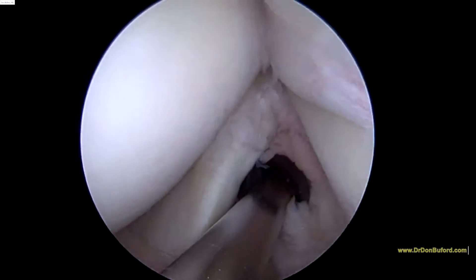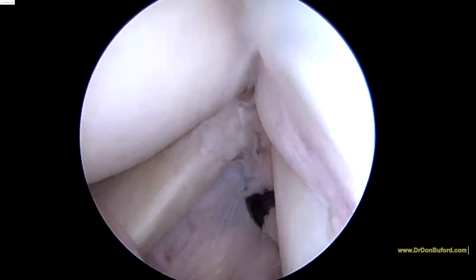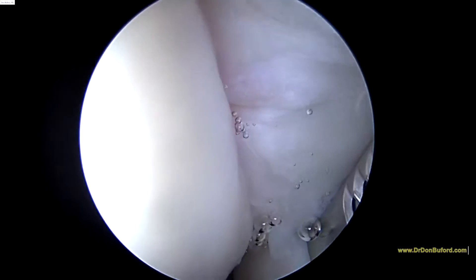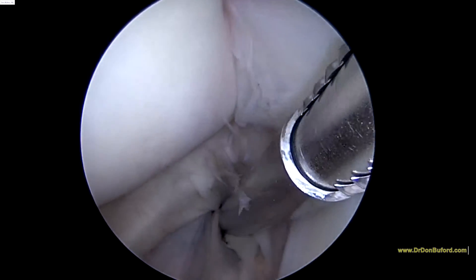We're going to come back up and look at the rotator cuff. I think we may have good news for you, at least on this side of the tendon. Things actually look pretty good. That really doesn't look like a tendon that's ever had any surgery. I'm happy with the way that looks for now.